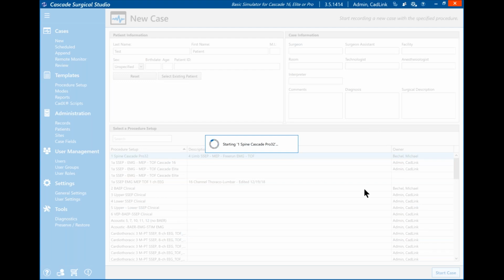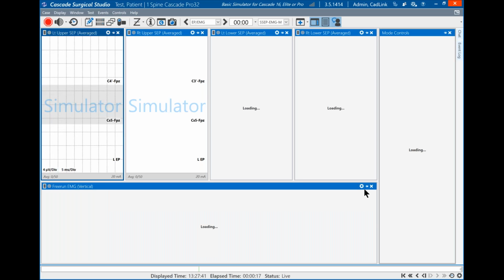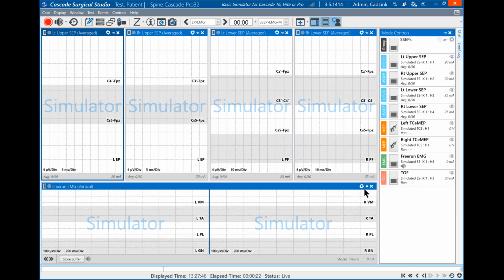It does take a little getting used to go lower right-hand corner. Just think lower right-hand corner to make your selections. It's a little bit different than in classic where you tended to go upper left-hand corner, but you'll get used to it very quickly.